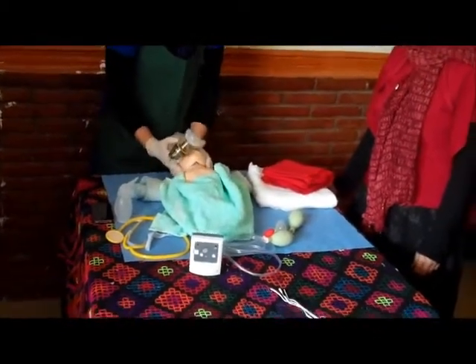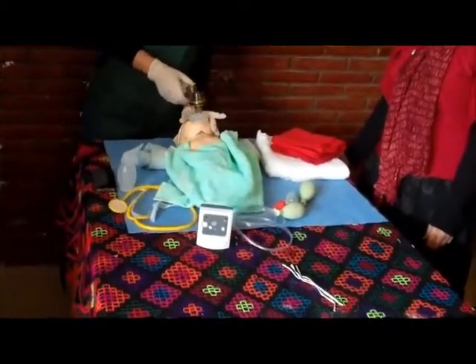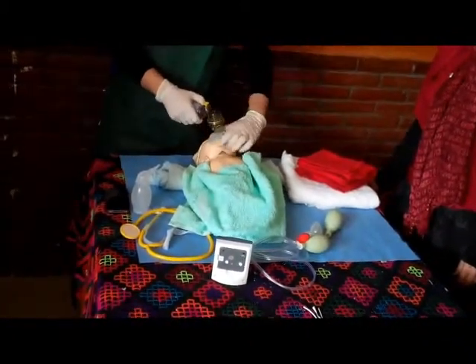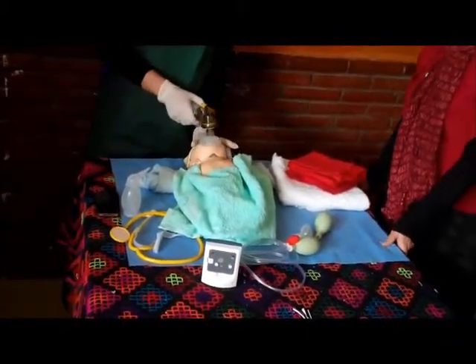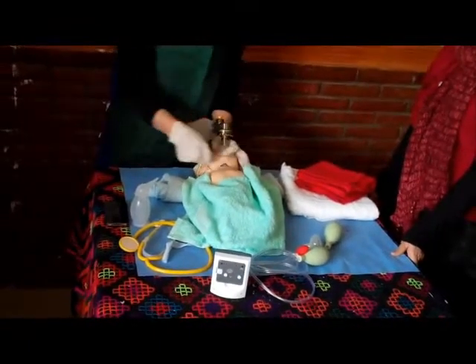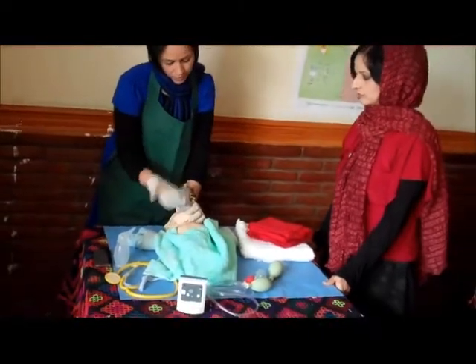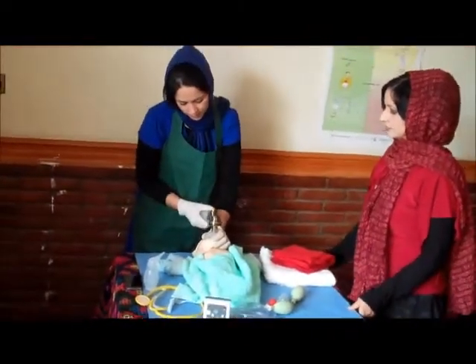We place the bag mask from the mouth, covering the mouth and nose. No air leak. We check the chest — yes, it is rising.